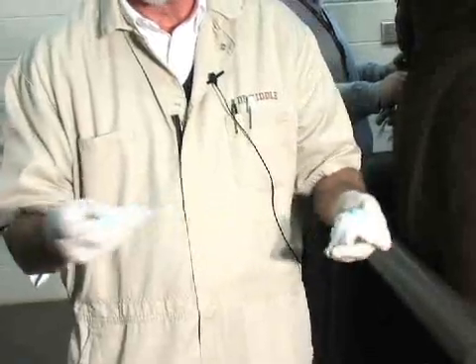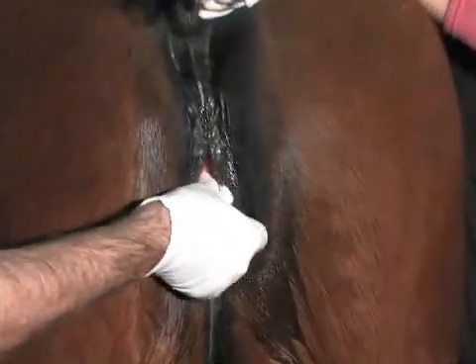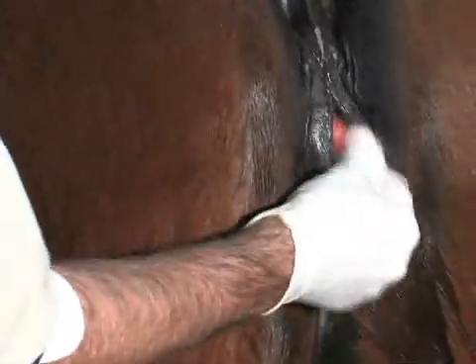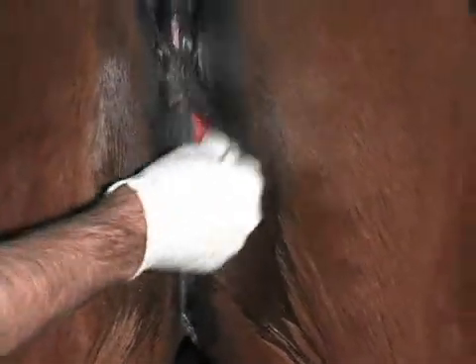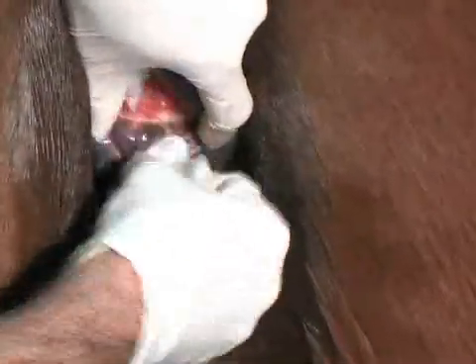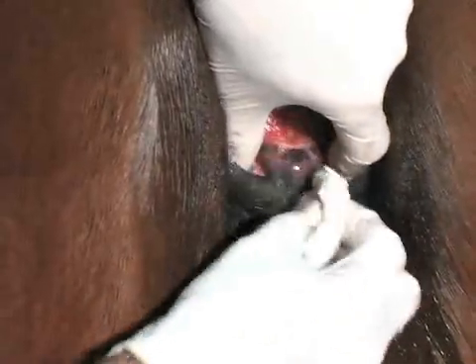Then we're going to scrub the mare with chlorhexidine scrub. The CEM organism is sensitive to a number of antimicrobials including chlorhexidine. Chlorhexidine has been my antimicrobial of choice. We want to make sure that we get the entire fossa region well and also scrub the clitoris. If there's any smegma in the sinuses, you want to make sure that has been fully removed and scrubbed.